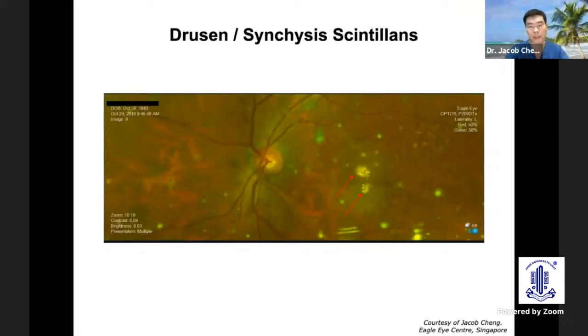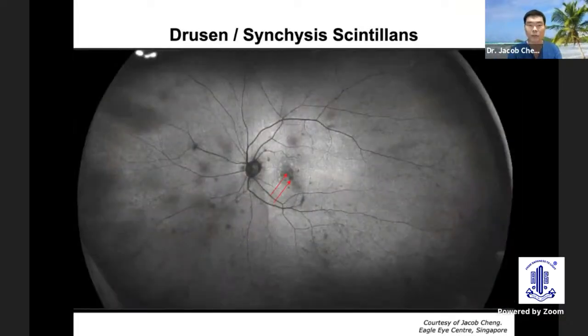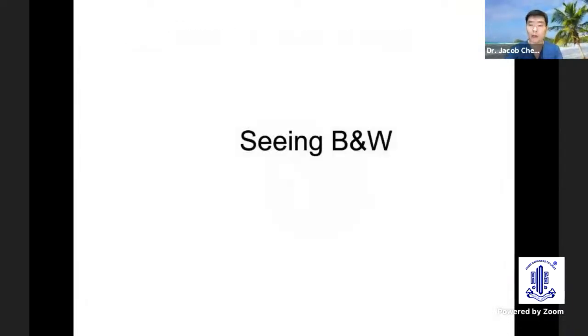It may look like on a white field, just like those crystals, but it's actually on the macula. Again, this will be confirmed on the autofluorescence looking at the red arrows. So this brings me to the next point of seeing black and white.